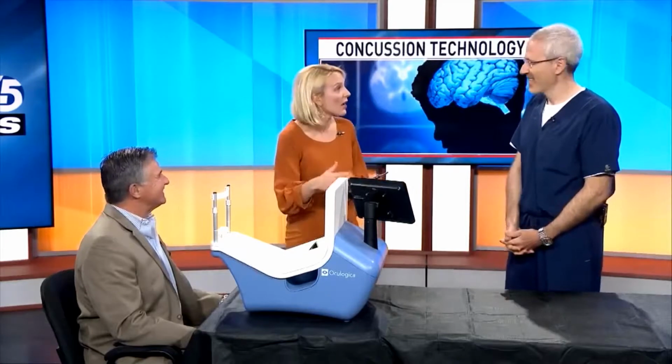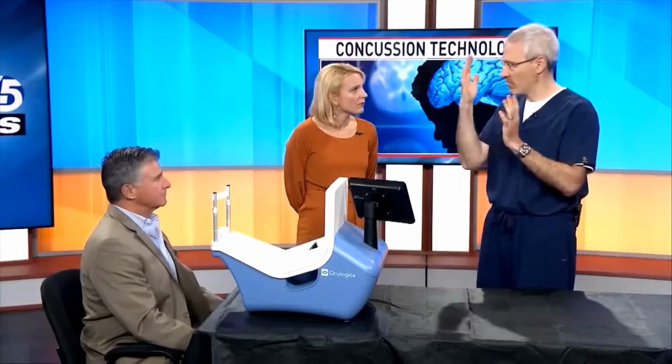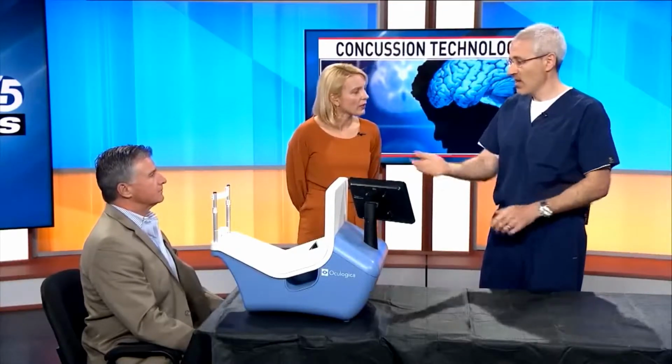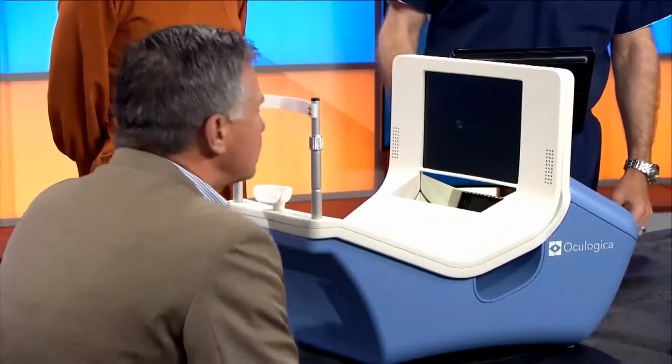I'm ready. Okay, so as the patient comes in, what's the first thing? Well, the first thing would be I would examine him and do the usual kind of concussion workup, you know, finger to nose and do all the looking at his eyes and all the rest of that stuff that we would normally do just to examine the patient. The next thing is I would have him make himself comfortable. I'd adjust the settings for him, which we've done beforehand. So I'd ask him to put his chin in the chin cup.